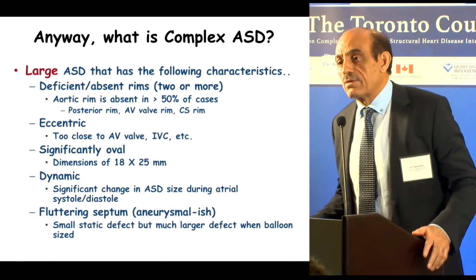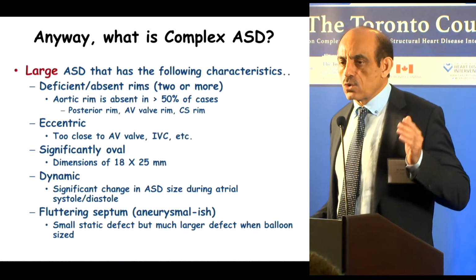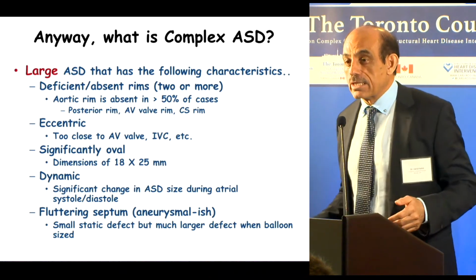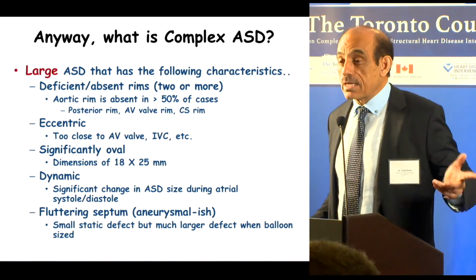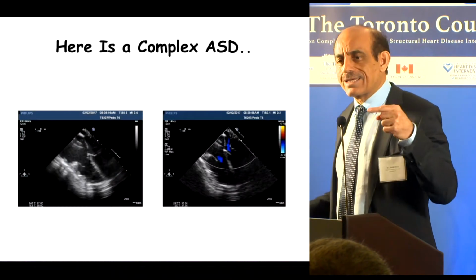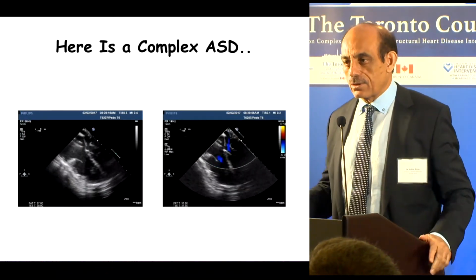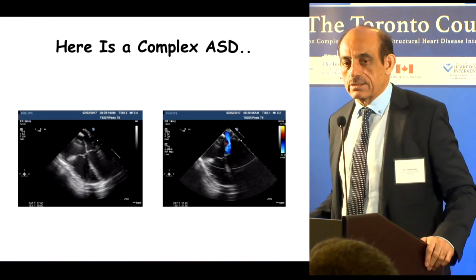And then I'm very much worried about ASDs where the septum is thin, you're almost always going to miss 2 or 3 defects, no matter how good you look at it. Maybe the illumination from the backside that John Carroll showed in a beautiful slide, maybe that will be helpful someday in that case. So this is a case I cathed initially for PDA closure, and then brought this patient back twice and still haven't been able to close it. I offered surgery to them. Mother doesn't want surgery. She's a beautiful young child.